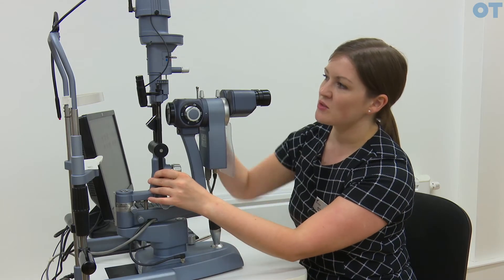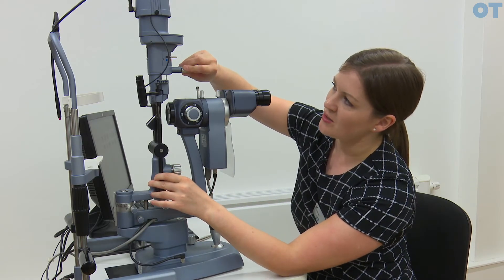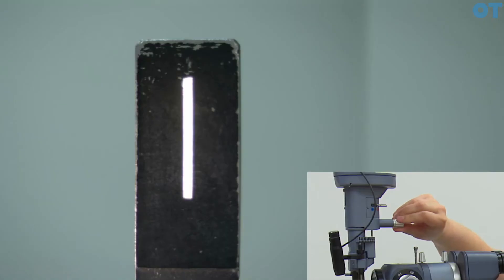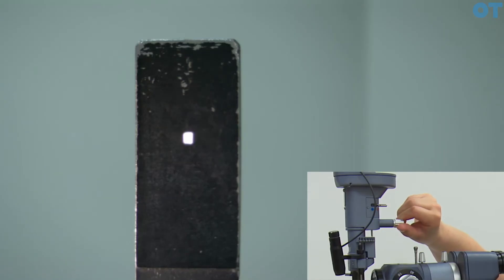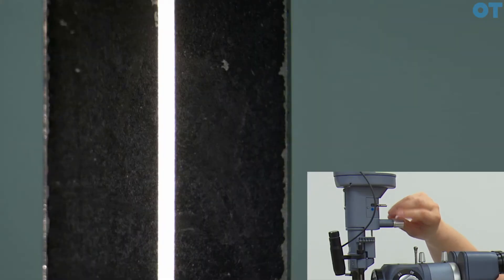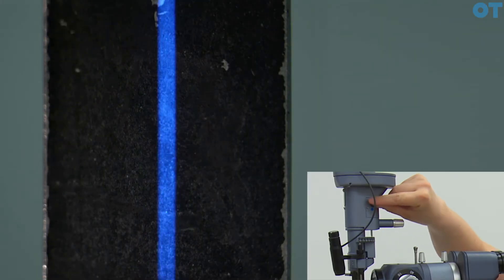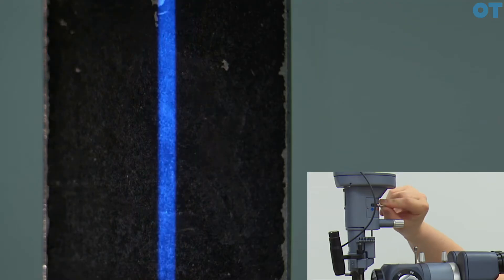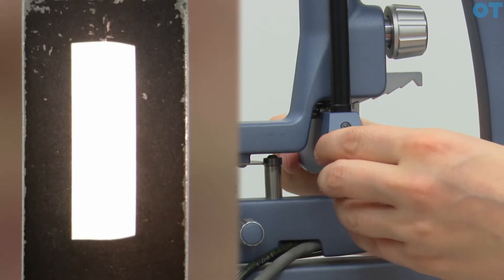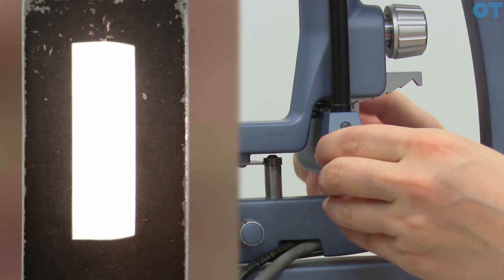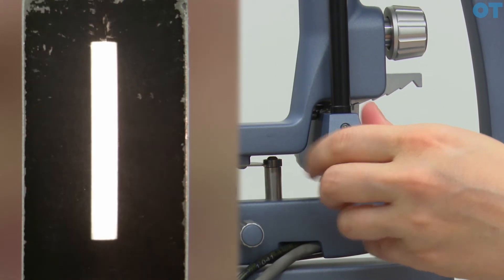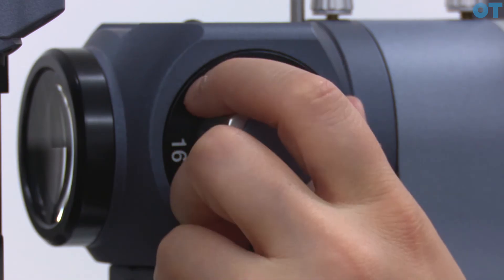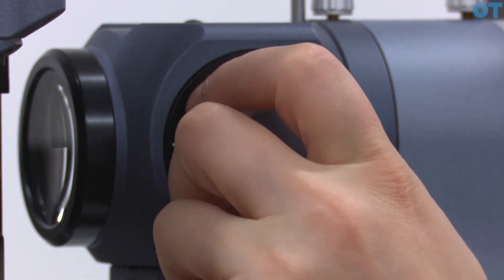With the Haag-Streit you have your illumination and your slit height at the top using this graticule here. We have filters which change the characteristics of the beam. We have our slit width here and magnification controls here.